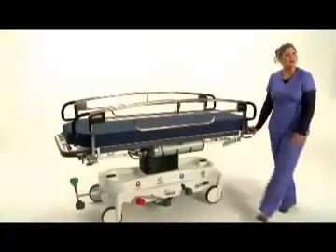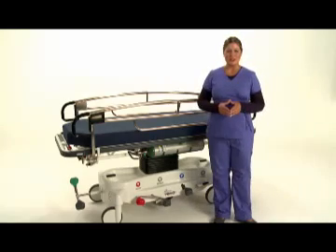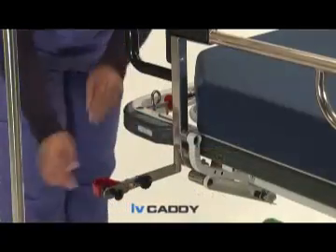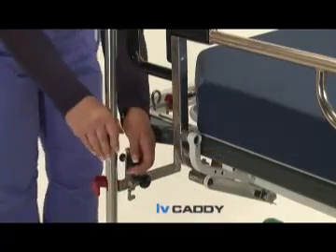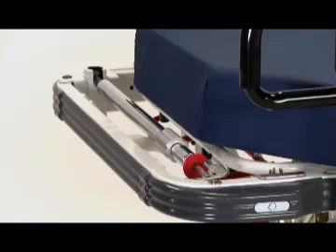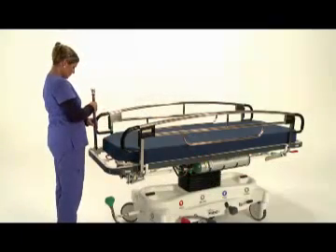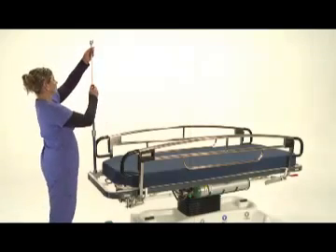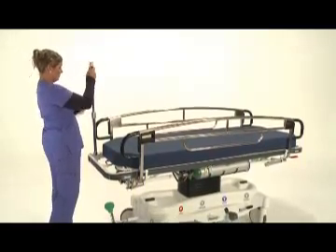Now I'd like to show you a few stretcher options when customizing your 7500 stretcher. First, this unique device, the IV Caddy, allows one caregiver to manage the safe transport of the patient and IV equipment. Or, add this convenient fold-down IV pole — foot or head-end mounted. Stand the pole up and place into the ball socket. Loosen the collar nut to extend the inner pole. Push up on the red release sleeve to raise the IV bag hooks even further. Collapse the telescoping poles and conveniently store out of the way when not needed.